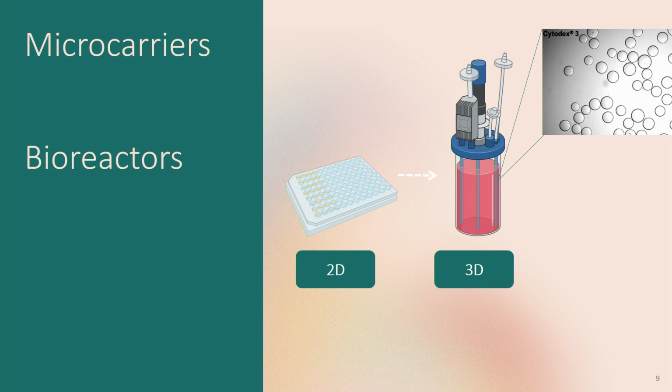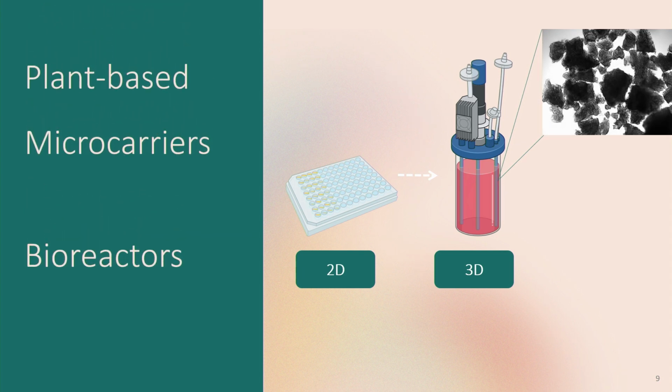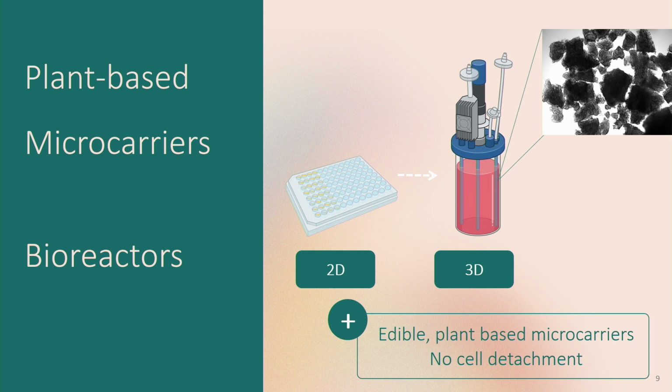The second part of my presentation, still about the same scaffold, because of course now we really like it. But now we move on to the microcarrier story. We all know, okay, we want to move from 2D to 3D, and we decided to create these plant-based microcarriers. Why did we want to do this? Because they are edible, fully plant-based, so you don't need any cell detachment anymore, right? You can just incorporate everything in your end product.